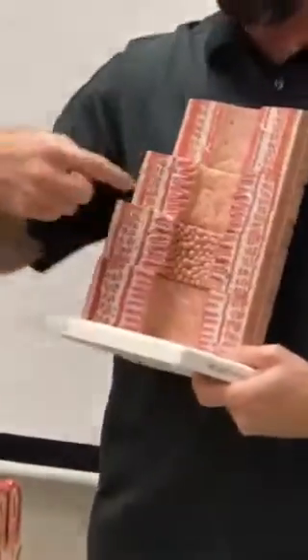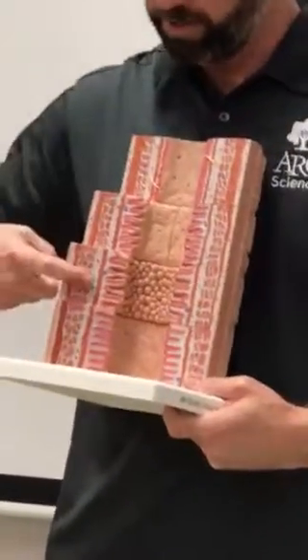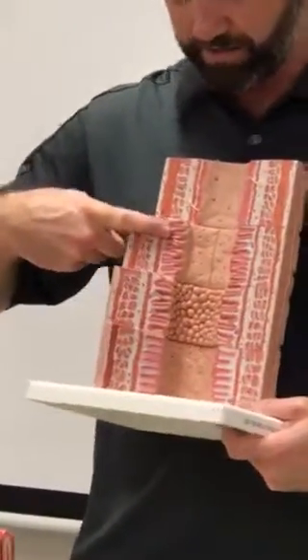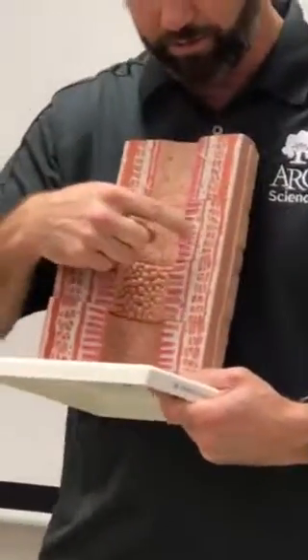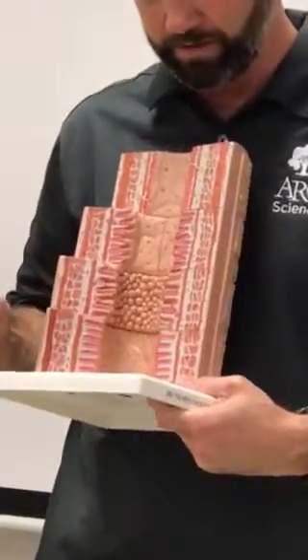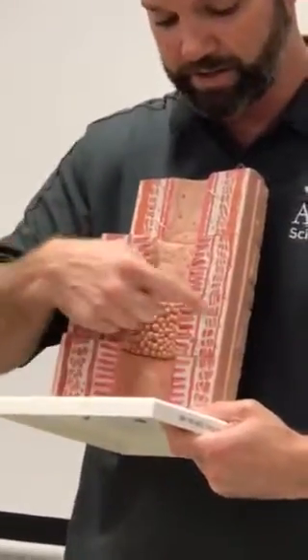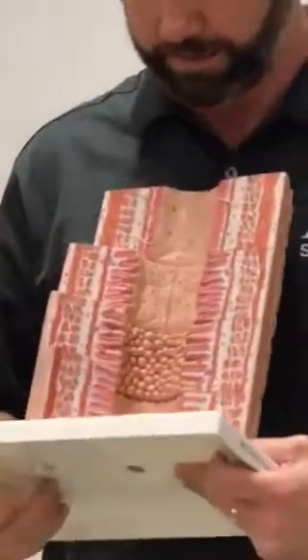Here, those bumps are villi, so this must be small intestine. So you have esophagus, small intestine. So this should be stomach, those are gastric pits, gastric glands. The problem is I only see 2 layers of muscularis externa. The muscularis externa here looks the same as it is there and there. So, mistake. There should be 3.